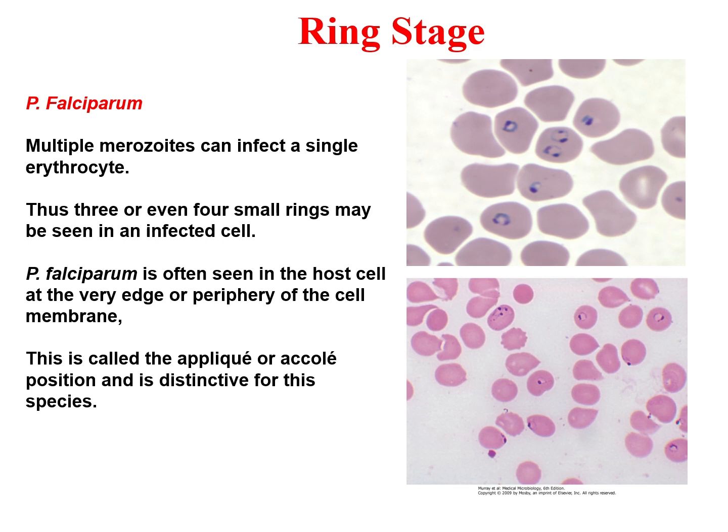And it's very important to note that because of the multiple infection of the same RBC, lysis of these RBCs happens faster, and this is why we do not see under the microscope the other stages, including the trophozoites or the merozoites in the schizont of Plasmodium falciparum. So what we see in terms of diagnosis are either the red blood cells that are infected with multiple rings that are at the edge of the membrane, or also the crescentric gametocytes that I will be showing in the coming slides.